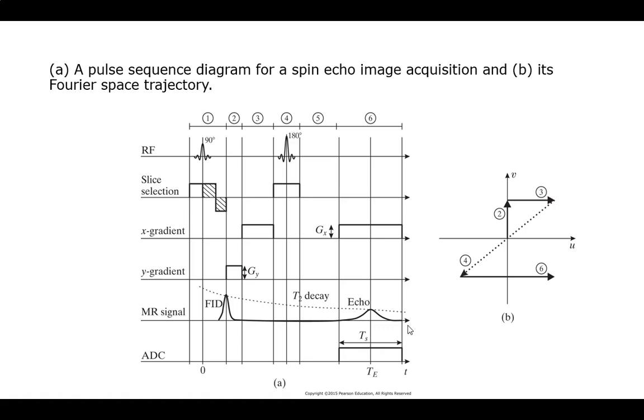Does that make sense? Okay, so then let's think it through. This again, slice selection, impulse, right? That selects our slice because of the resonance frequency. Once that is done, right? Now here is my FID stuff that's starting, and I would be measuring FID, but I can't measure FID. It's not doing what I want. I need an echo pulse. So this is no good, so I'm not going to measure that. But that is what's happening.